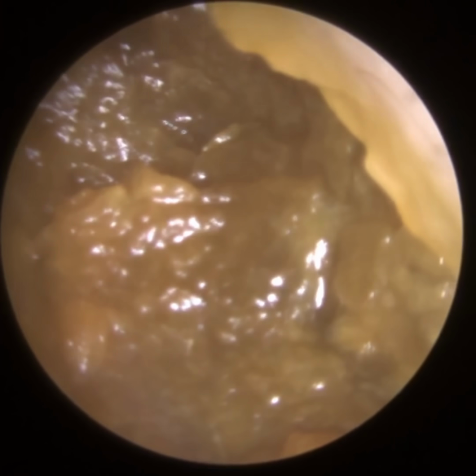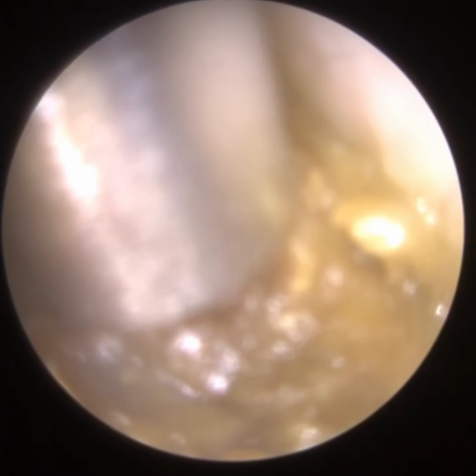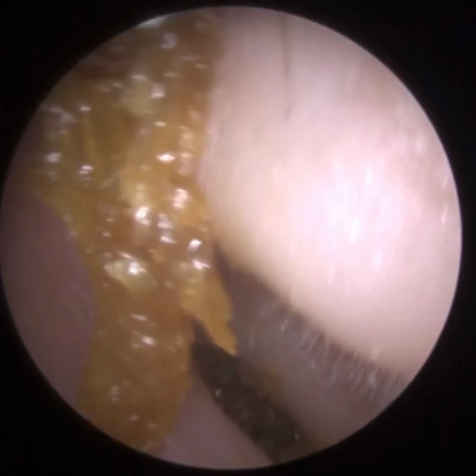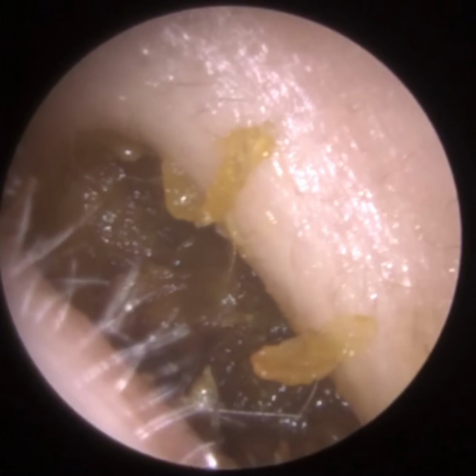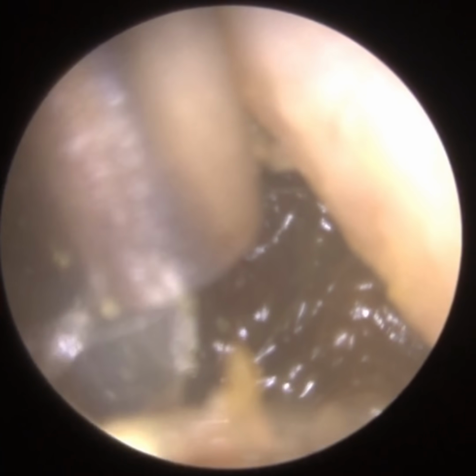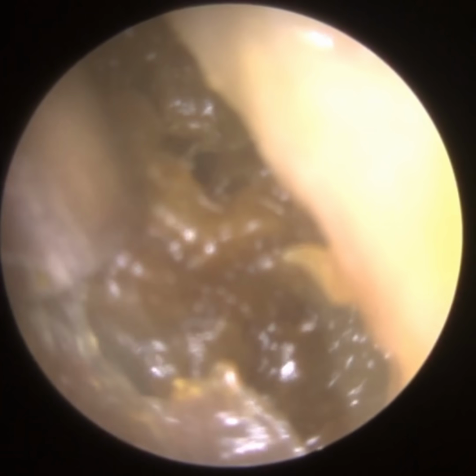So for a patient who attended with a fully blocked right ear, their ear canal was very narrow and very slit. And when I say slit, everyone's ear canals are oval shaped. Therefore, the height of the ear canal is greater than the width. However, in this patient, it was more elongated, even more pronounced. So the height was far more significant than the width, which gives it a slit appearance. Therefore, we had to navigate into the ear safely without making contact with the canal walls.